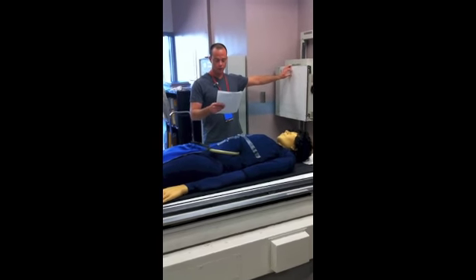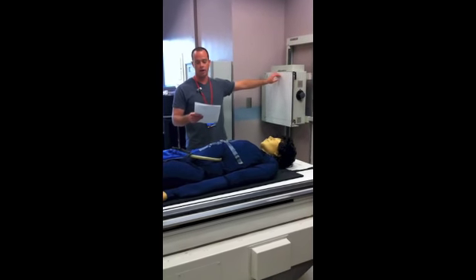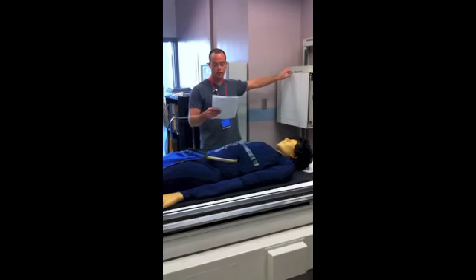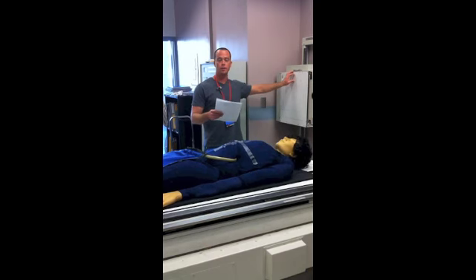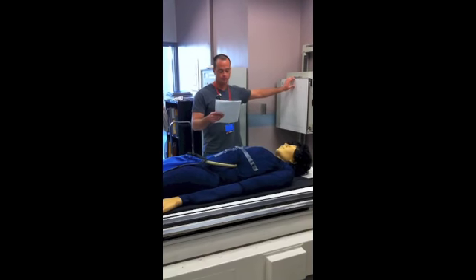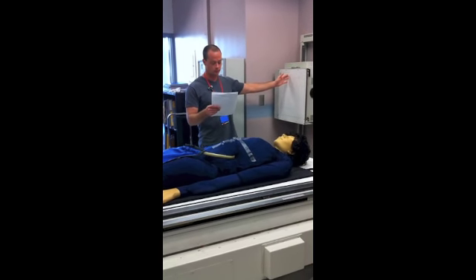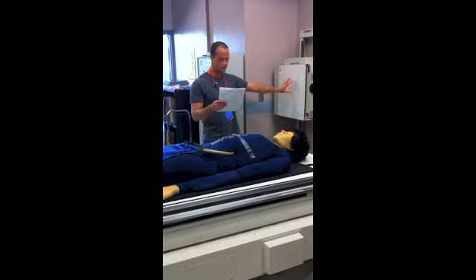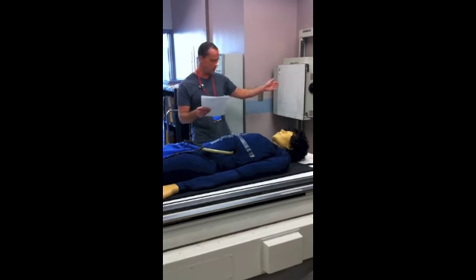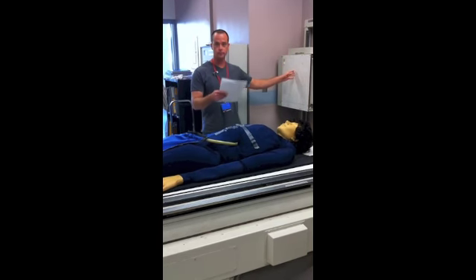I want roughly the upper border of the IR to be roughly 1.5 to 2 inches above the relaxed shoulders. Forgot to mention that with PA. You want that for both PA chest and for lateral. Now with this one, the patient's mid-sagittal plane will be parallel with the IR. The thorax centered to the grid, roughly right here, and the mid-coronal plane will be perpendicular to the IR.